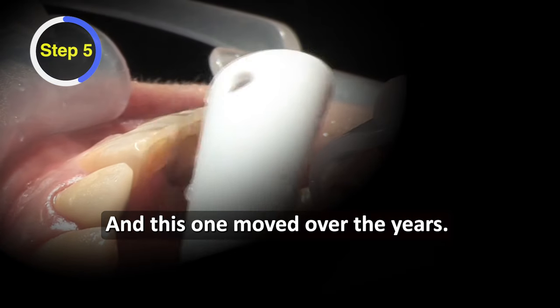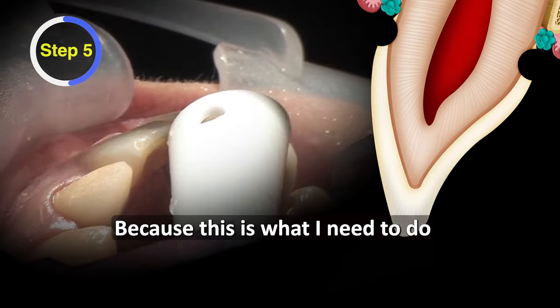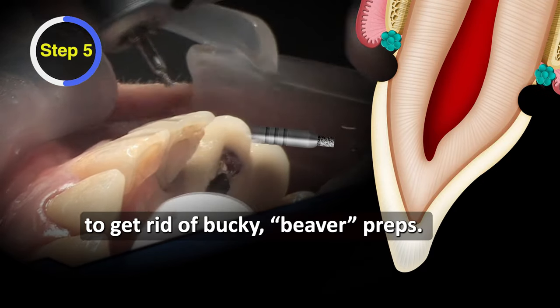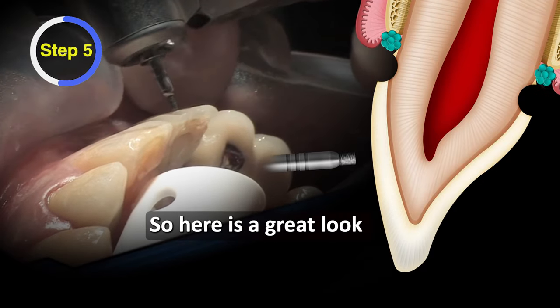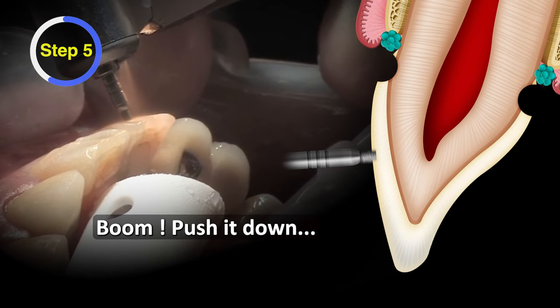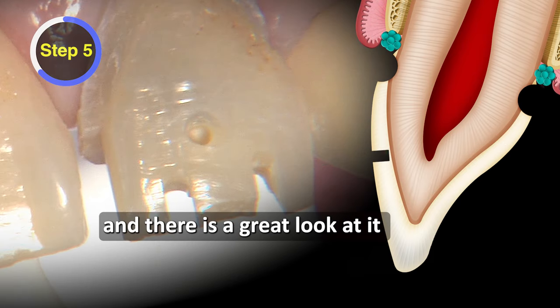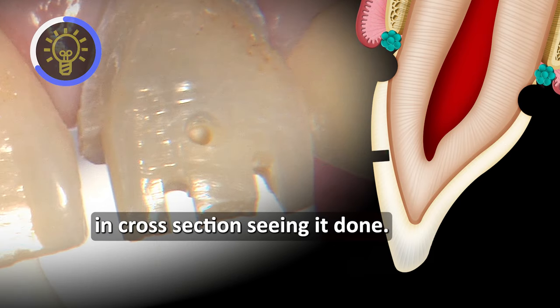This one moved over the years, closer and closer to the incisal edge, because this is what I needed to do to get rid of my bucky beaver preps. Here's a great look at what this depth cut actually looks like. Start up the handpiece, push it down until it seats and won't go any farther. That's how quick these depth cuts are, and it was a great look at it in cross section seeing it done.